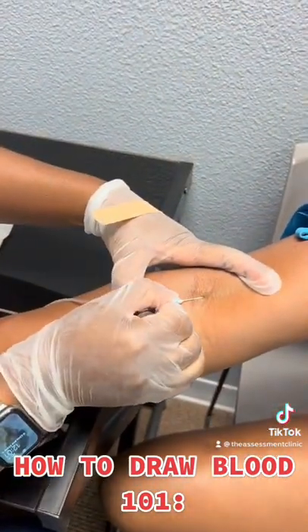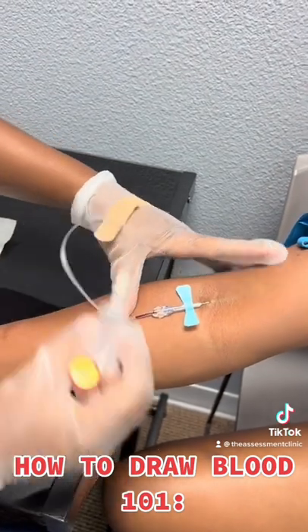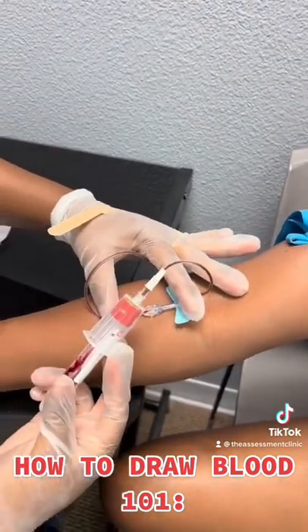Insert the needle, watch for a flash, use the tubing and the vacutainer to collect the blood.